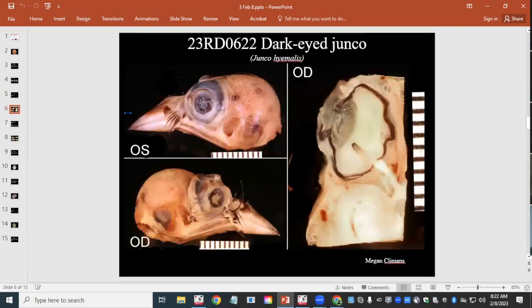The next case is a dark-eyed junco, a wild bird. It was observed striking a window and initially responded well to treatment for head trauma, but developed ocular anomalies. The eye was too severely affected for release, making the bird unreleasable.